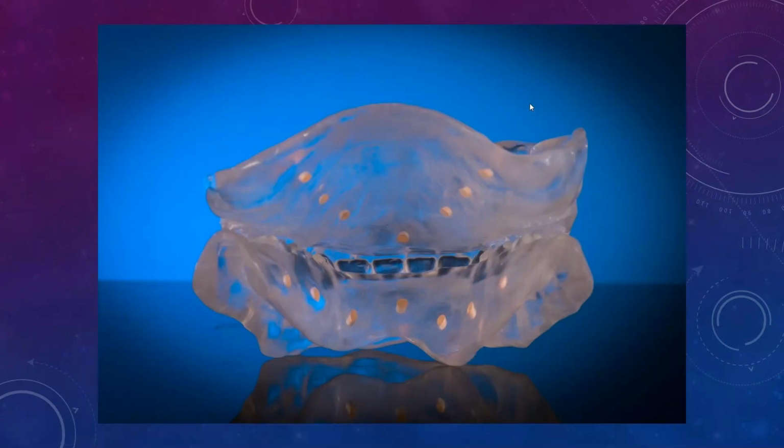Once you fabricate that denture, once you measure everything, once you know what things are going to be doing, and you decide, okay, let's say, for example, I got a moderate defect and I want to do a hybrid. Well, we need to plan for proper bone reduction and we need to plan for proper implant placement. Now, there's several ways you can do surgical guides, and not surgical guides, I'm sorry. Several ways you can do scan guides, guys.